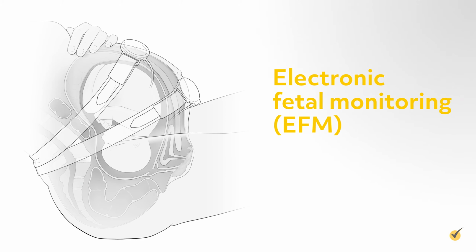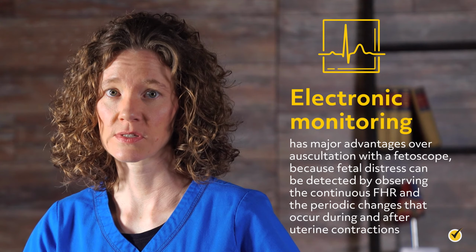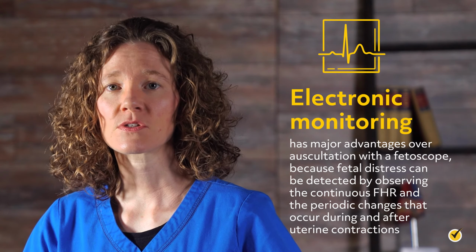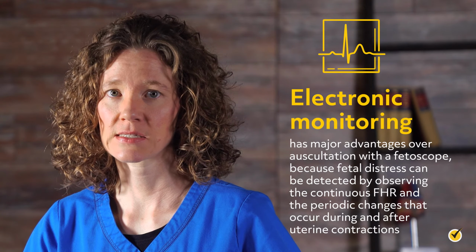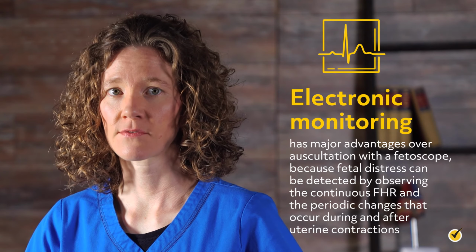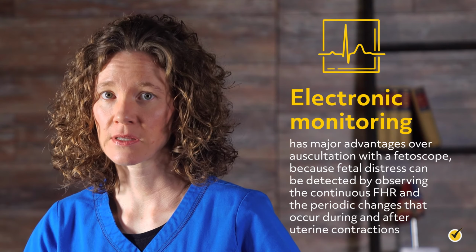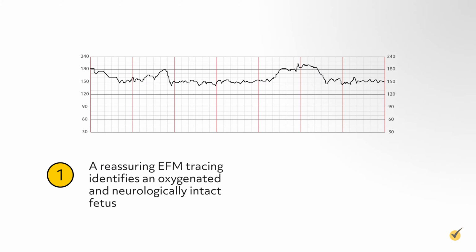Electronic fetal monitoring, or EFM, is frequently used to provide a visual assessment of the fetal heart rate, which is especially beneficial during labor. Electronic monitoring has major advantages over auscultation with a fetoscope because fetal distress can be detected by observing the continuous fetal heart rate and the periodic changes that occur during and after uterine contractions. Therefore, interventions can be timely and more effective. A reassuring EFM tracing identifies an oxygenated and neurologically intact fetus.